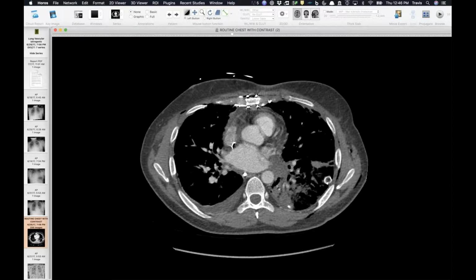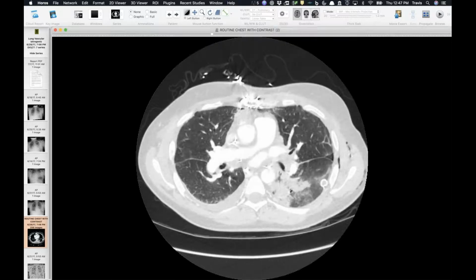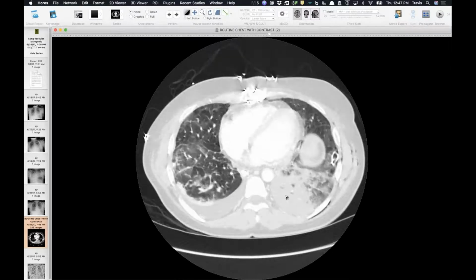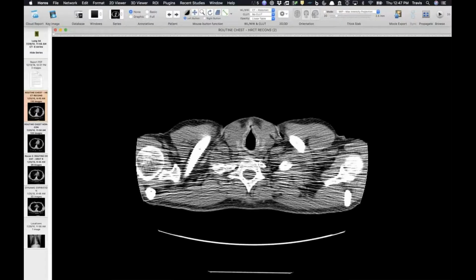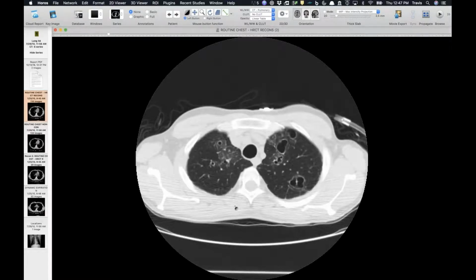There were a lot of adhesions. She tried to reconstruct this left inferior pulmonary vein. So not too dissimilar to Seth's case of the pulmonary vein occlusion being caused by lymphoma, but in this case just iatrogenic. But I show that because I have more information on this patient. I was reading another follow-up study on him, and I saw an interesting history which tied into his original lung disease back in, well, before 2010. And so he was, I don't know how old at this time, in his 30s, I think.